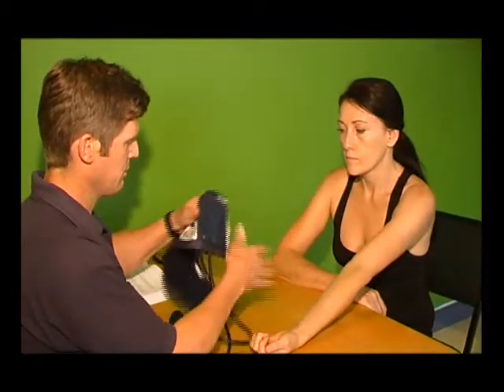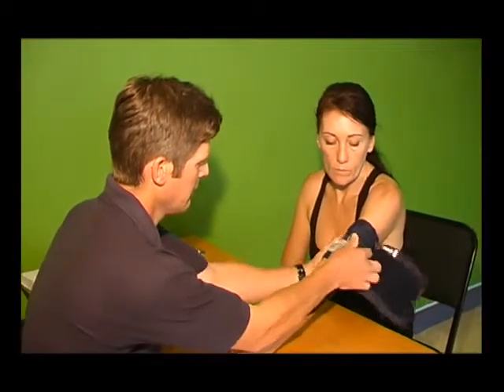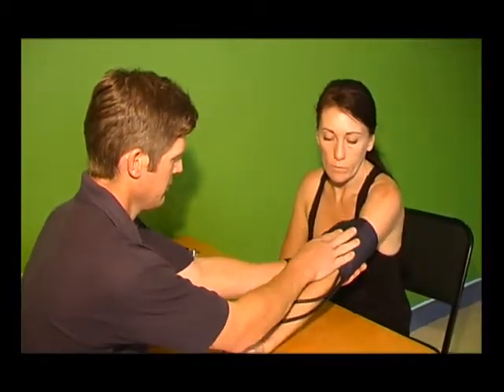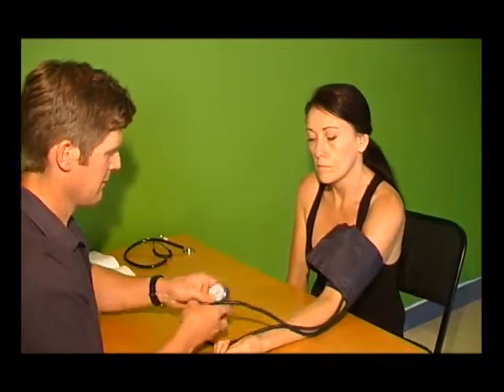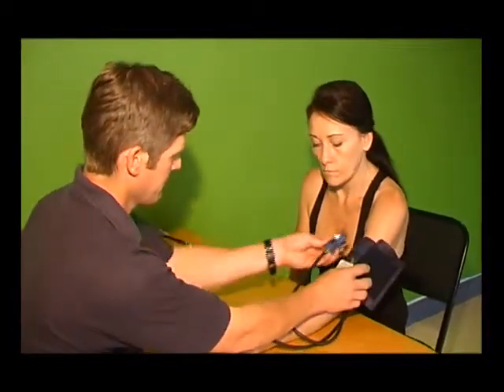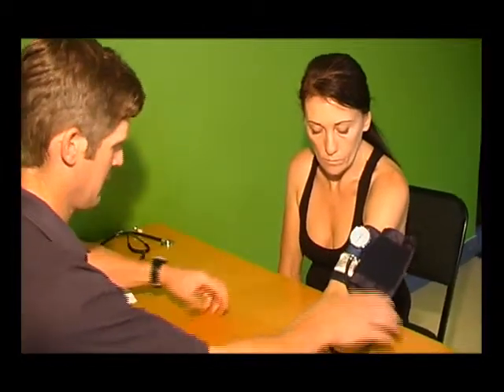Place the client's left arm on the table with the elbow extended at heart level. The bladder of the cuff should be directly on the brachial artery. Use the left arm on the table with the elbow extended over the medial area of the elbow joint. Detect the cuff around the left arm approximately two fingers above the elbow joint at the level of the heart.